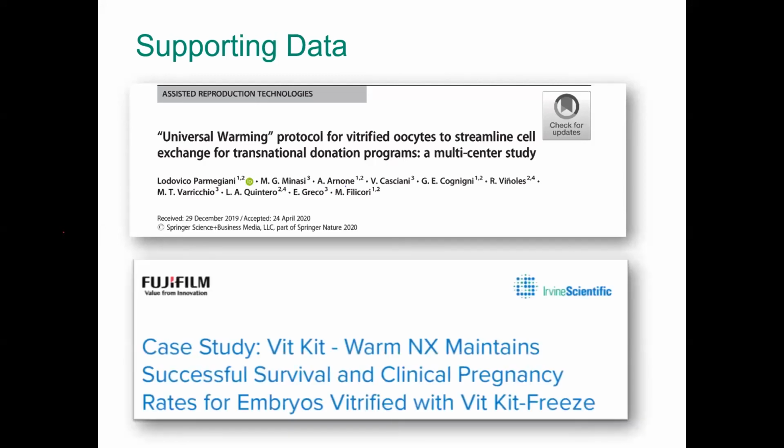Another study, also recent, found that even if you use media with different base media, that did not affect your results. So the idea of using a different media than the one originally used for freezing is not that risky, but I think we need more and more studies to see whether cross thawing between all available media in the market is possible or not.